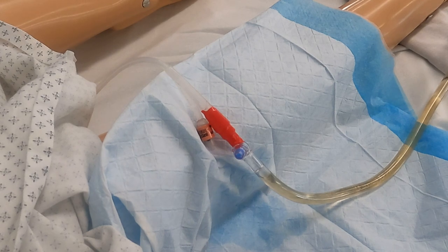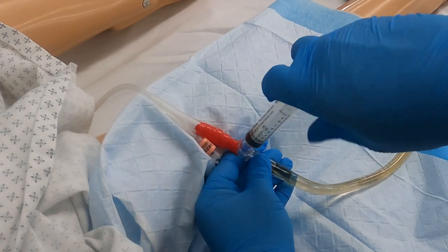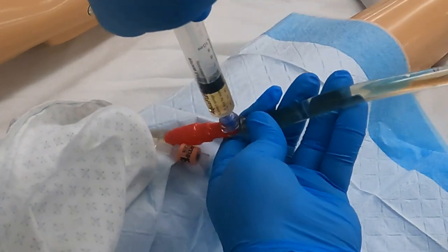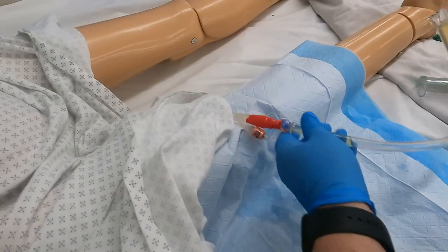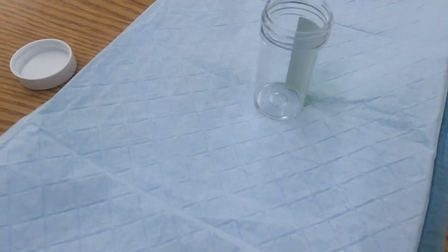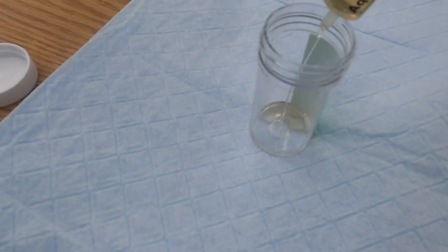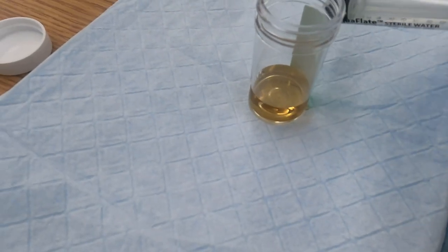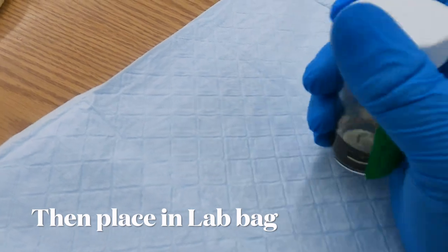Then you're going to take your clean sterile 10cc syringe and screw it onto the luer lock port, then go ahead and withdraw. Now I've gotten more than 10cc's of urine, so I can come over to my table. Take your 10cc syringe and go ahead and shoot it into your collection chamber. Dispose of your syringe and go ahead and cap it.